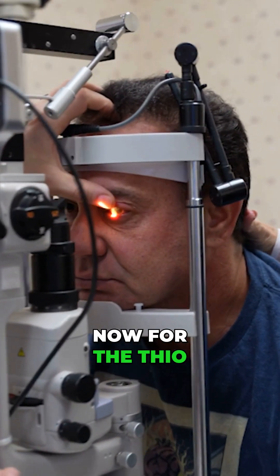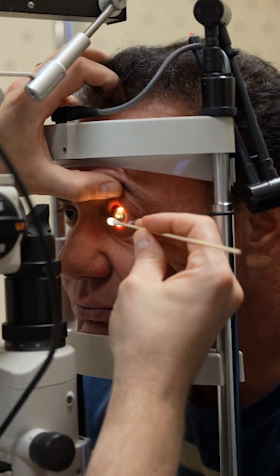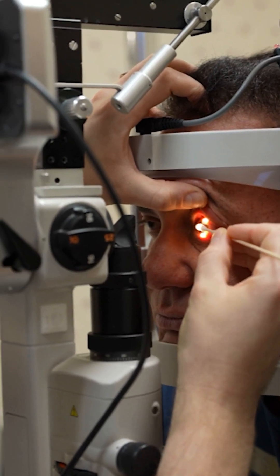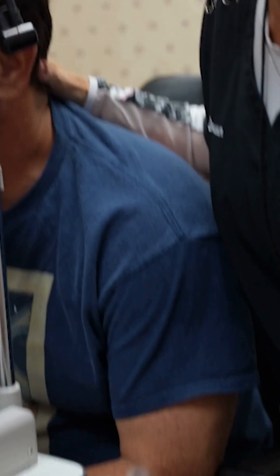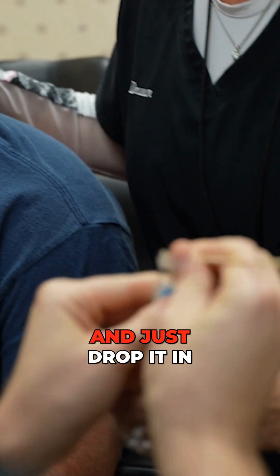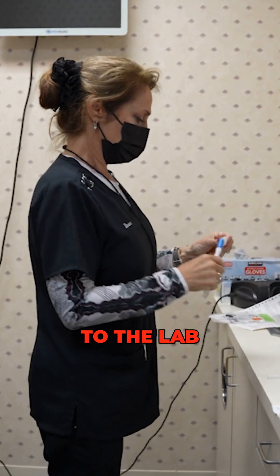For the thio and for the fungal plate, we basically take a clean cotton swab. We'll label that and send those off to the lab.